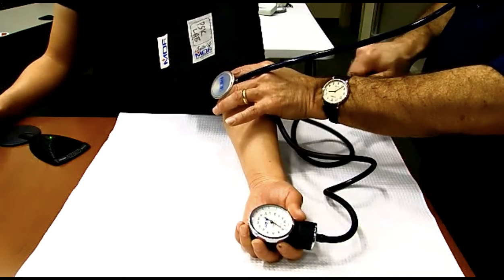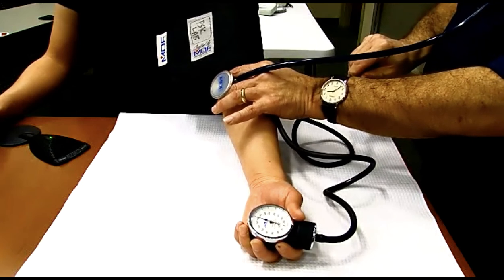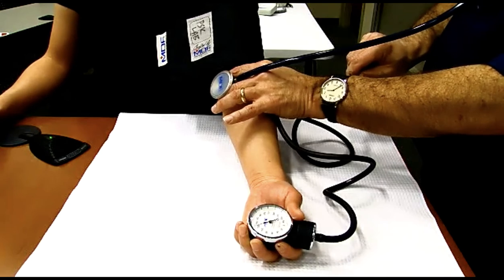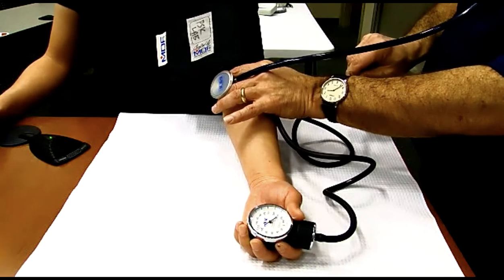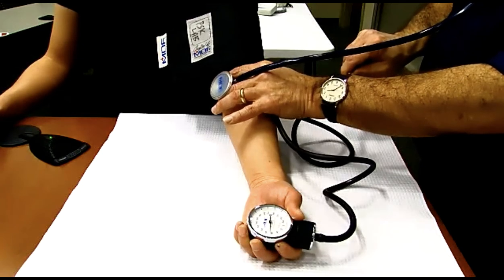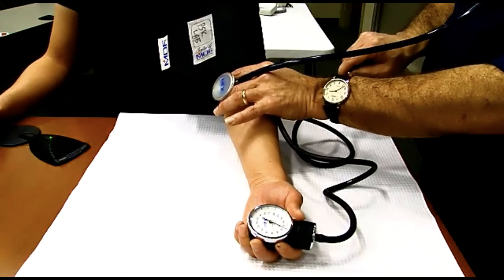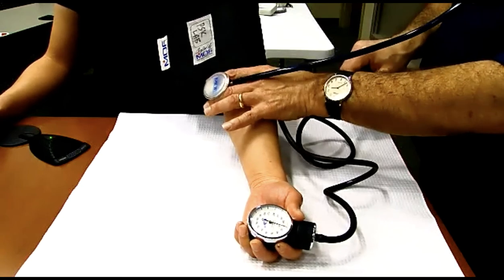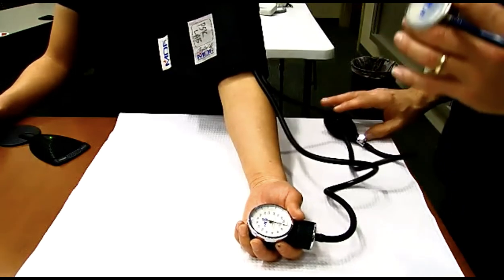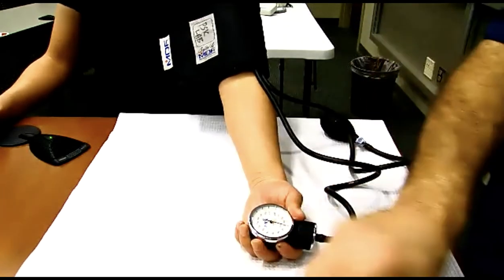That was really fast. So again, the idea is to show you how to do it. You get up to where you want, and then you got to kind of just control. I'm hoping you can kind of maybe see the rate at which that's deflating. And again, the first sound I hear was the systolic, and then the last sound I heard was the diastolic. So the first sound I heard was around 92, I think, and then it went away at around 64. So I would give her a 92 over 64 as my final reading, and your pulse rate was 80.